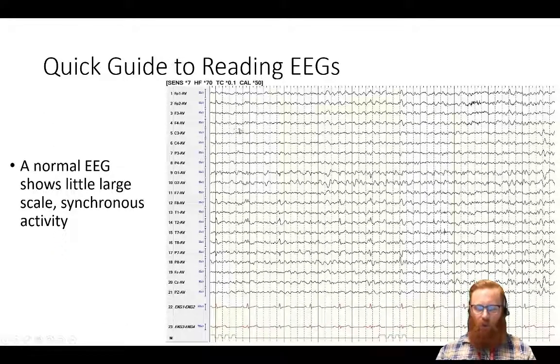Now, what you usually report the EEG as is the recording at one place minus a recording in another place. So this one shows you the frontal one electrode minus the average of all of these, right?